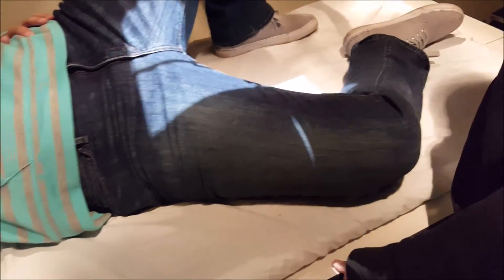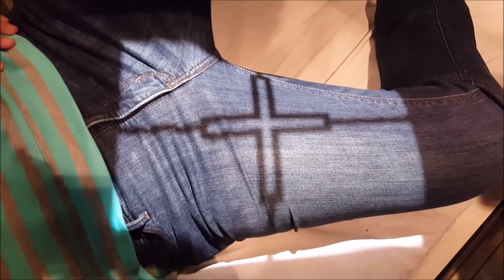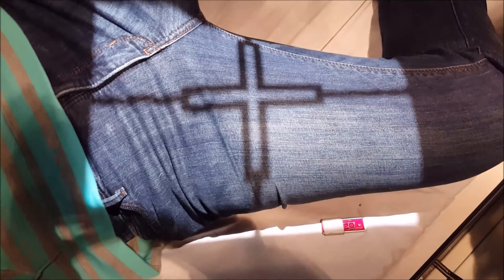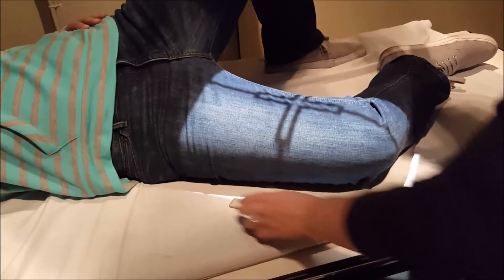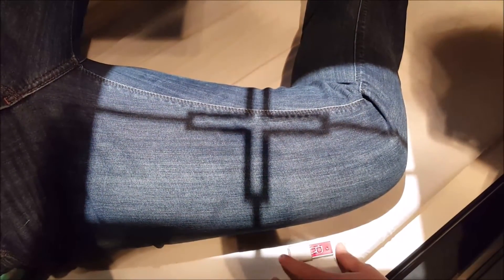We're going to start with the proximal femur, and we're looking for the same criteria, so I'm going to angle the tube to go with the long axis of the femur. ASIS is here, so I want to put the top of my IR at ASIS and we're going to go right down the knee here. We're going to place our marker on the lateral edge of the patient's anatomy. For the distal femur, I'm going to move the patient so that I have a little bit of light just past the knee here — we want to make sure we're getting a good lateral knee. That right there is the positioning for the lateral femur.